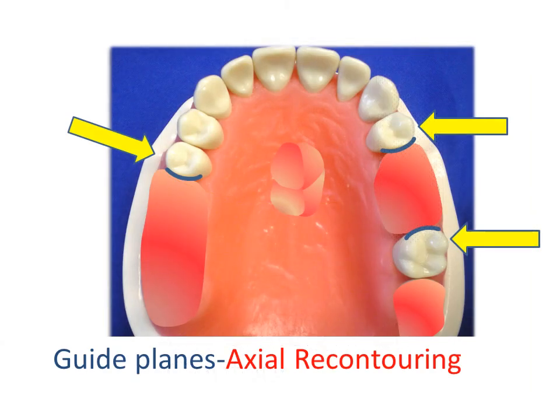For purposes of illustration, the guide planes are in blue, and areas to be recontoured are in red. One should mark these areas on the diagnostic cast.